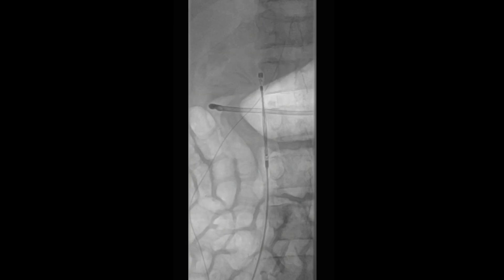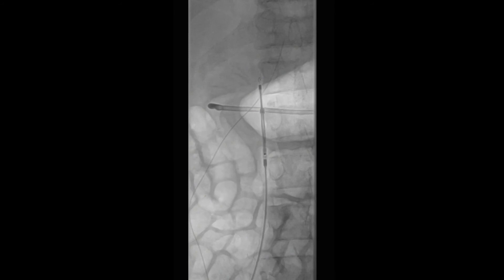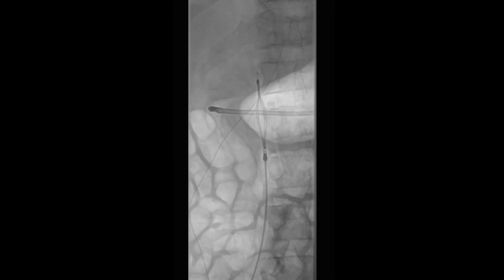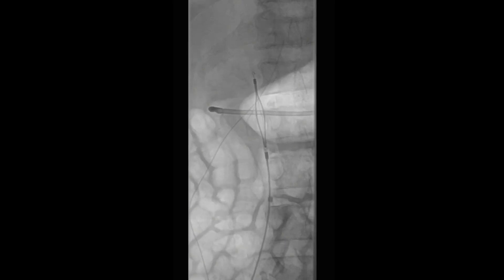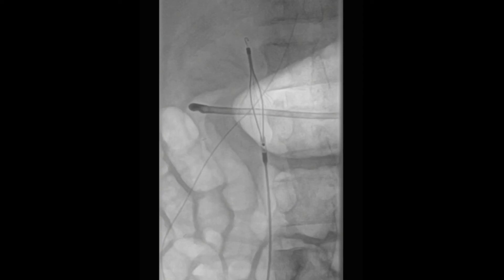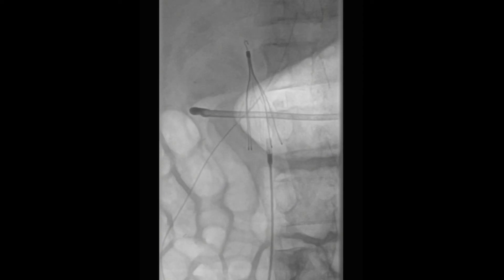Once the filter hook is advanced to the level of the lowest renal vein, the sheath is gently retracted over this IVC filter. The filter is then subsequently deployed, as demonstrated here in this video.